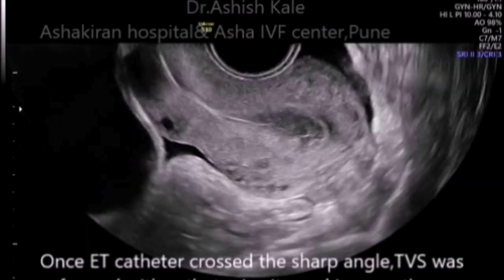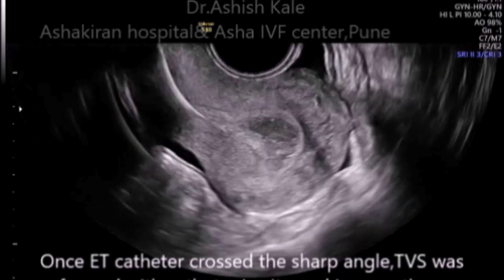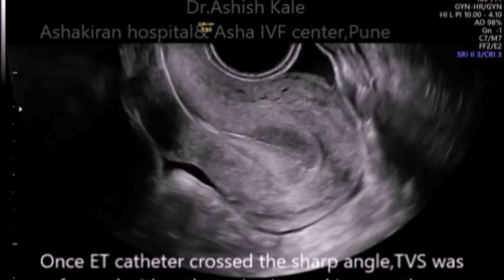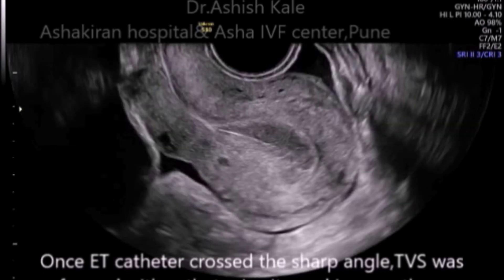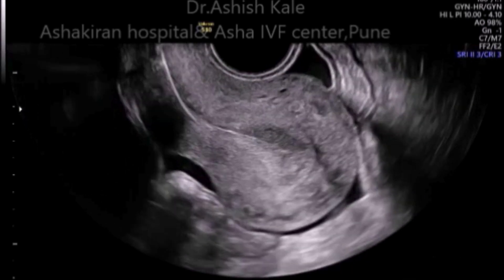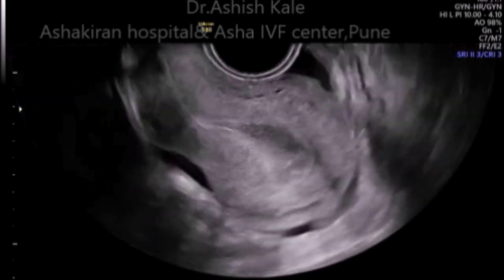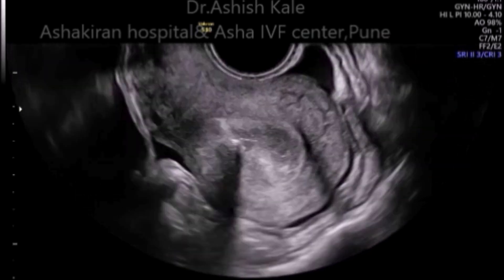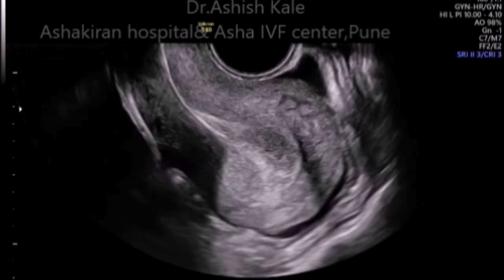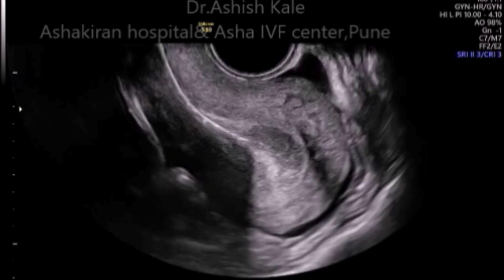Here you can all appreciate this is the view we actually get. We then shifted to trans-vaginal ultrasonography once the ET catheter passed through the sharp angle. The TVS was performed with the catheter in situ. We used the stylet for secure locking of the catheter. When I remove the stylet, the whole catheter can be visualized from the internal os to the uterine cavity, and the tip of the catheter is very well appreciated.